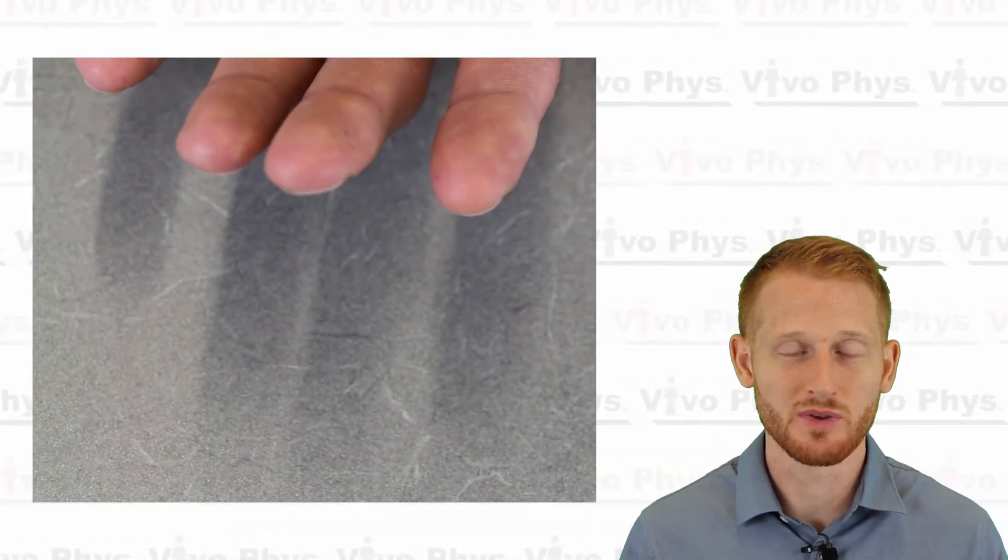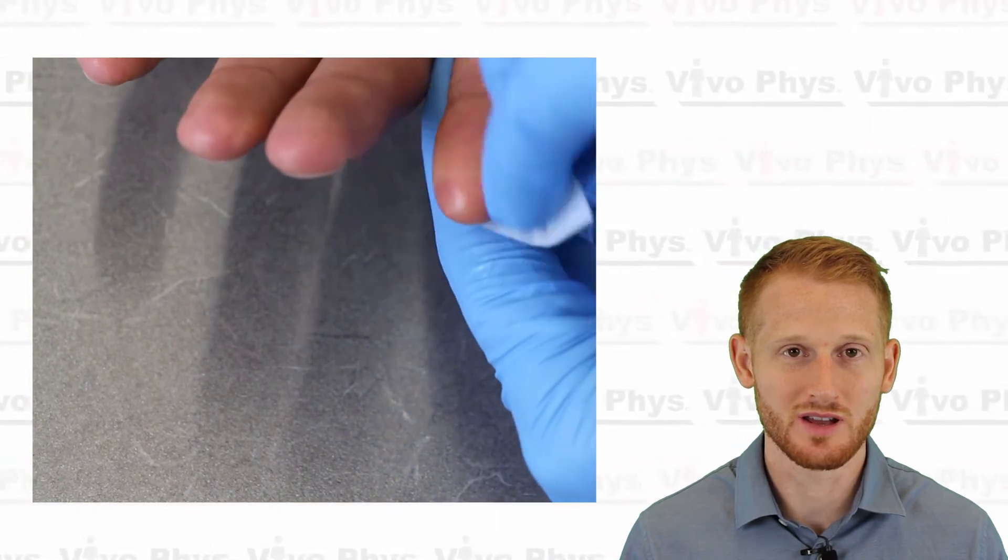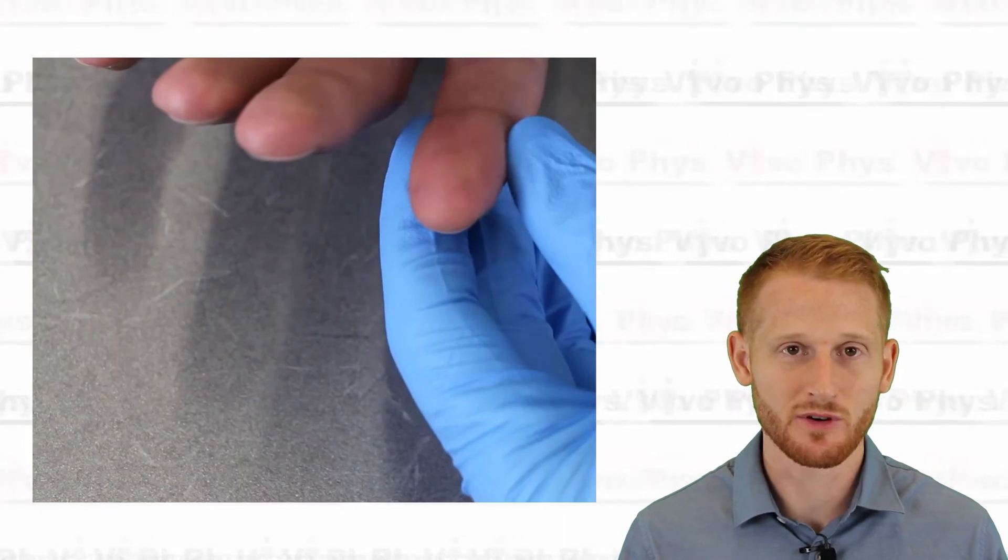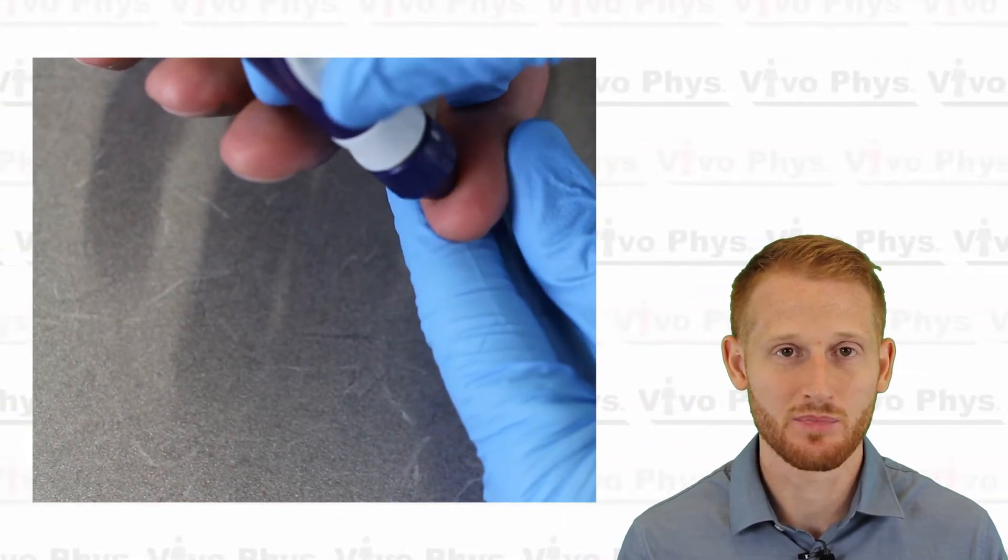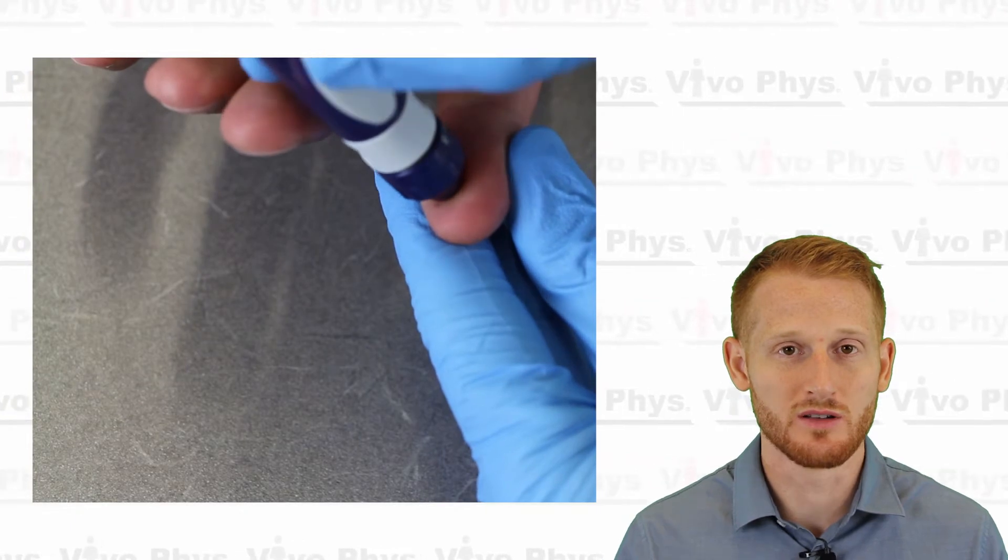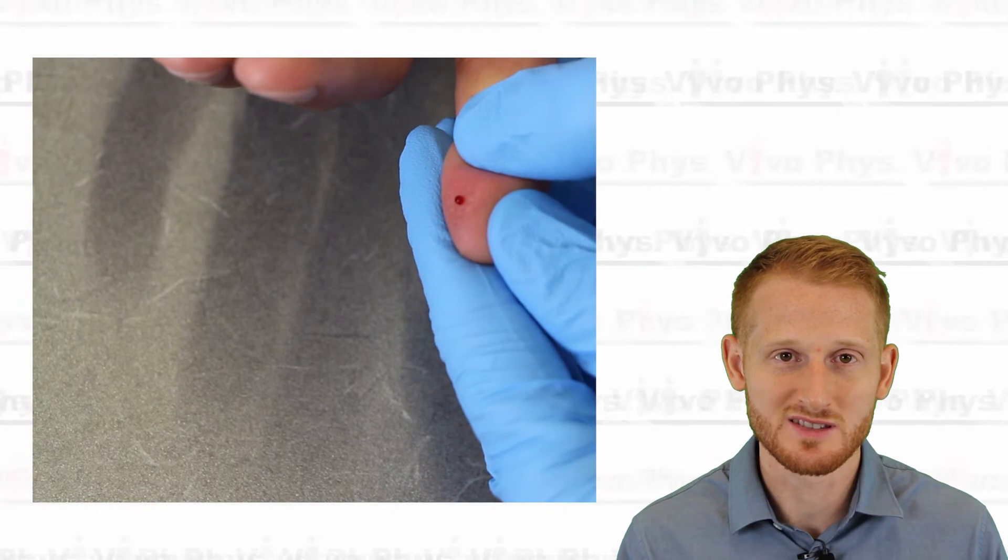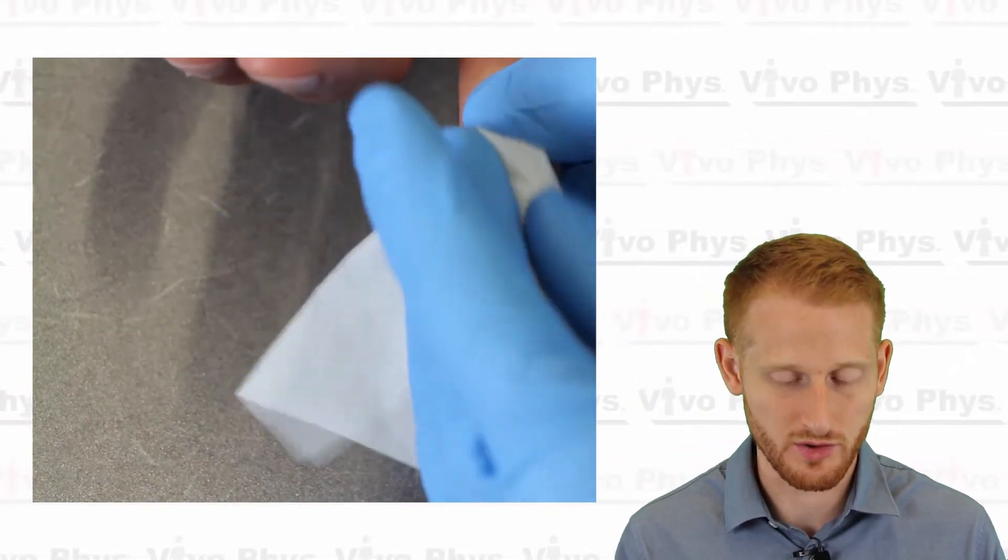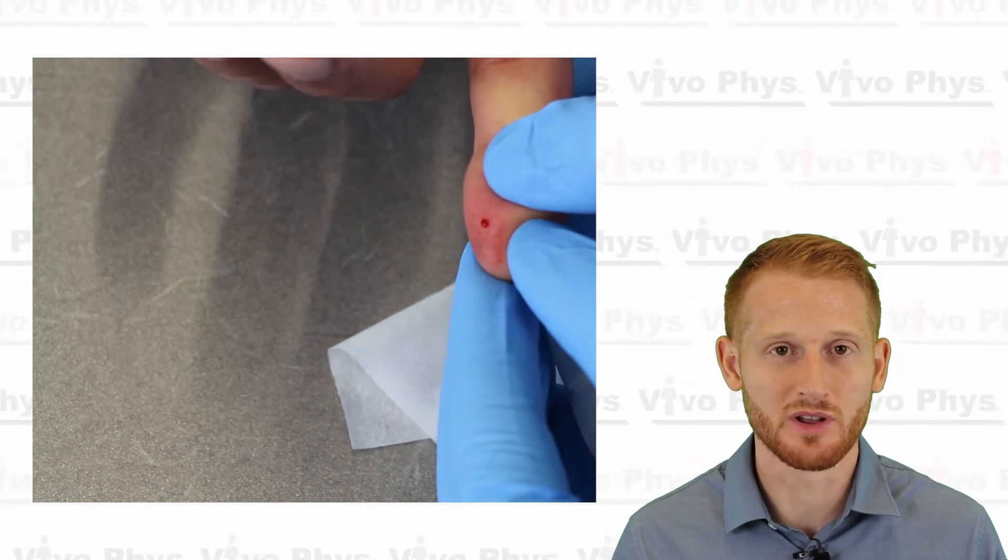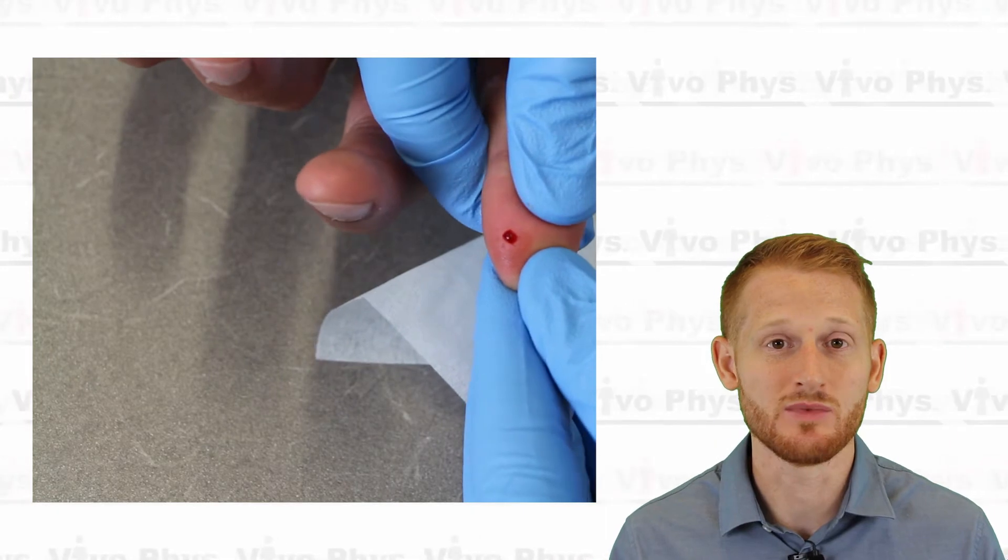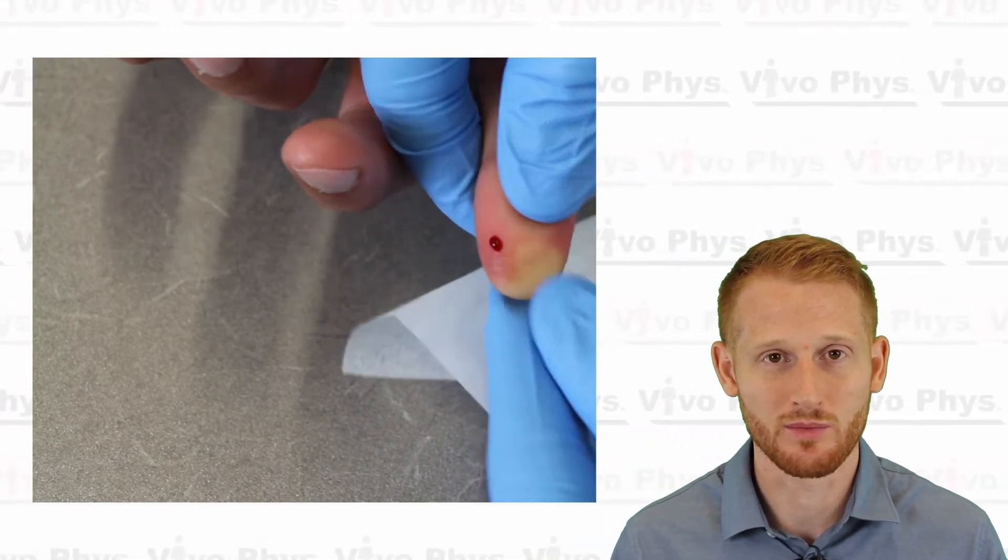So once the lancet gun is ready to use we're simply going to take the finger. We're going to clean it with a little bit of alcohol so we can make sure that it's going to be as sanitary as possible for the person. Allow that alcohol to dry and then firmly press the lancet gun onto the finger and push the trigger button to allow the lancet to go into the skin and pierce the skin slightly. Think of it like a tube of toothpaste. Squeeze a little bit of blood out of the hole that you created and then wipe that first drop of blood away with some sort of absorbent tissue. Something that's going to keep the area clean like a kim wipe or a piece of gauze.